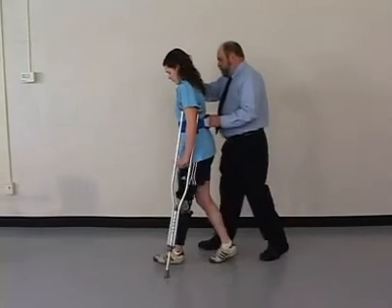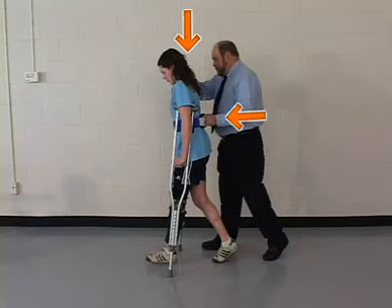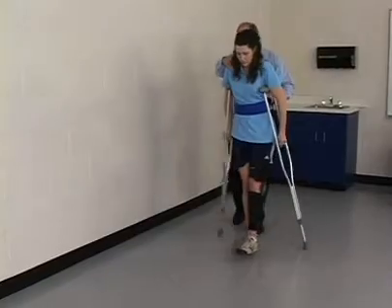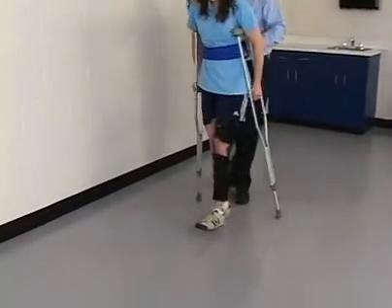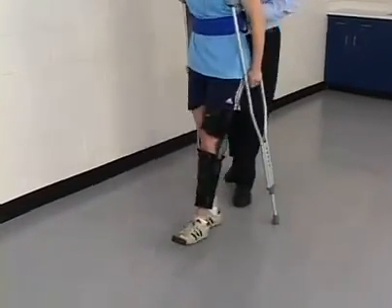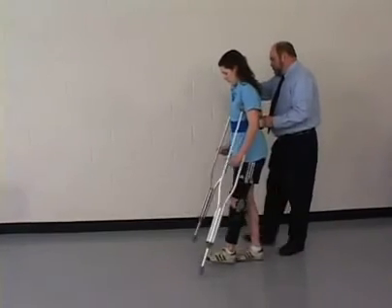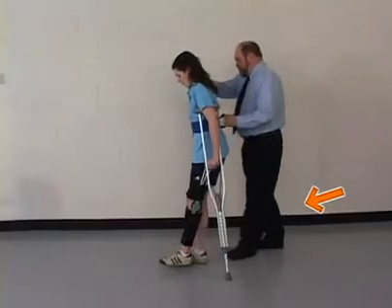The therapist holds the gait belt and the patient's shoulder. To ambulate, both crutches and the involved lower extremity are advanced simultaneously and the same amount. Meanwhile, the therapist moves his right or outside foot forward either at the same time or immediately after the crutches are advanced.